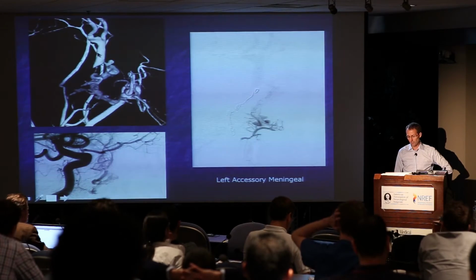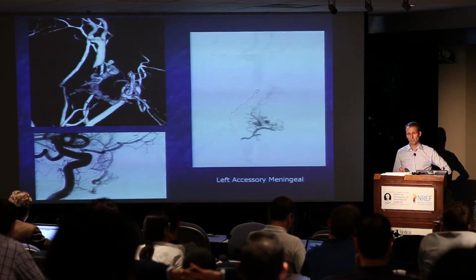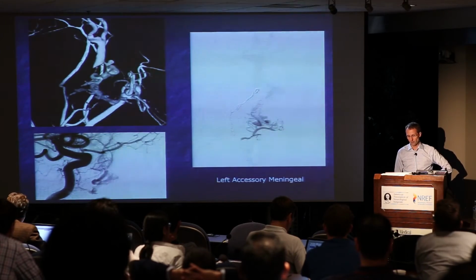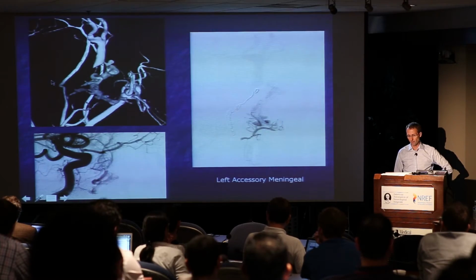We know what the venous outflow is, so we know what our target is, but we're more concerned with the onyx going places we don't want it to go, okay? So hopefully we've eliminated this, this is the MMA that we've now coiled off. We hopefully have eliminated that.